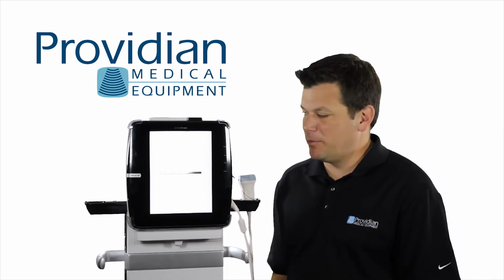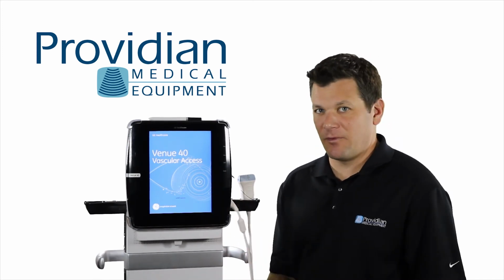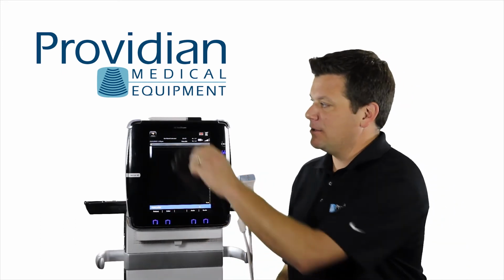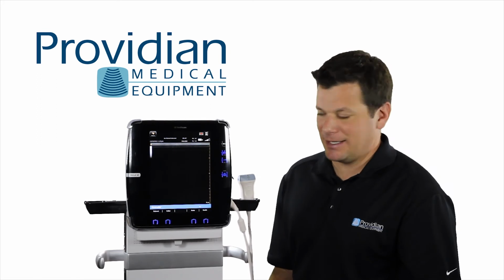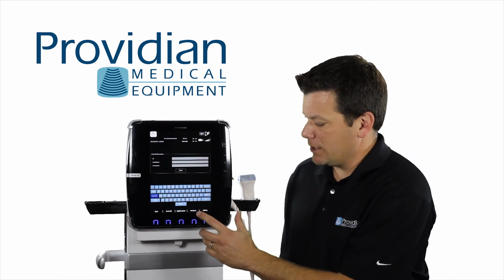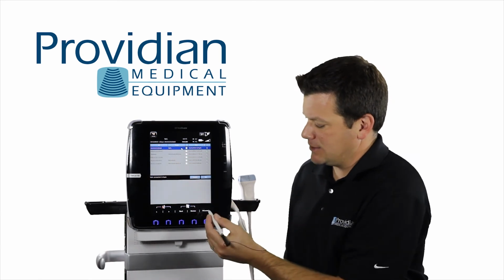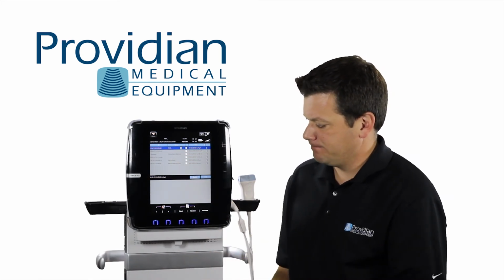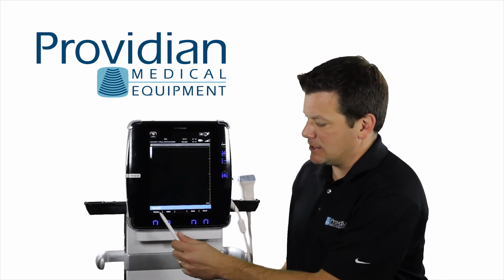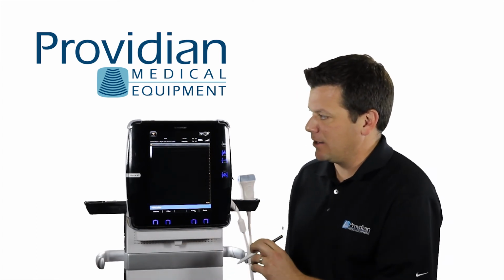So I powered down the system to reboot it, and here, as it boots, now it says vascular access. That is the overall package that's going to be running when I get that patient ID. So I've rebooted, it lost that no patient selected, so let's say I want to resume that exam. I'm going to go ahead and click patient down here. I'm going to go to archive and I'm going to reselect this patient, test, and hit resume. Okay, so now it's set at the general vascular setting. And notice down here it says patient color instead of PDI, which it was set at before. We have our auto optimization and our needle guide.